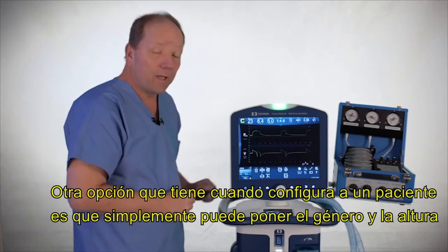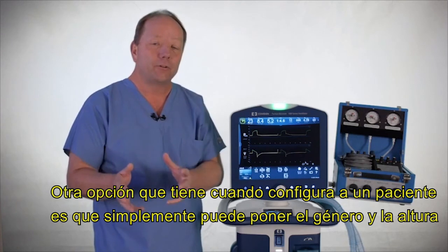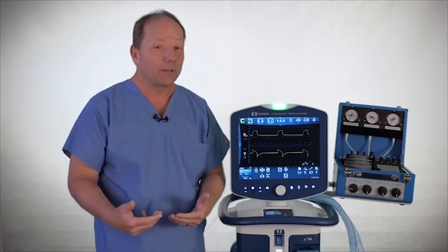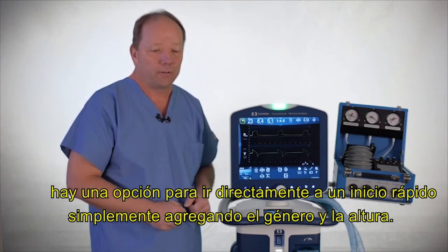One other option that you have when you set a patient up is you could just put in the gender and the height, and then you can go right to what's called a quick start. So if you're comfortable with all the settings, and you need to get going very quickly, there is an option to go right to a quick start by simply putting in the gender and the height.